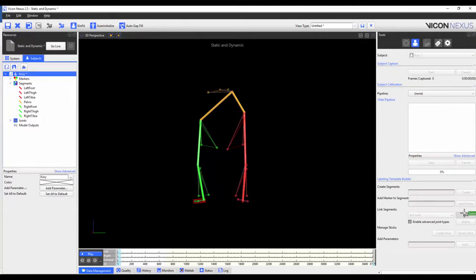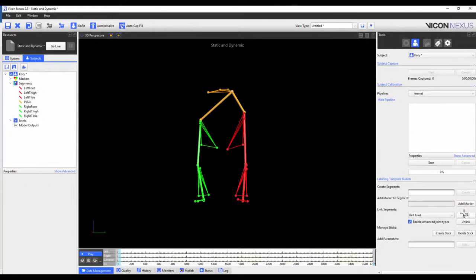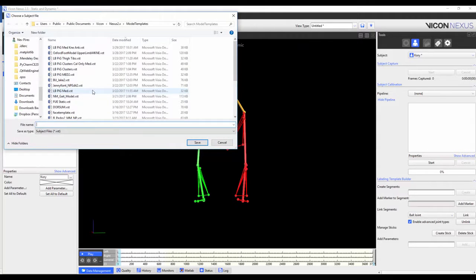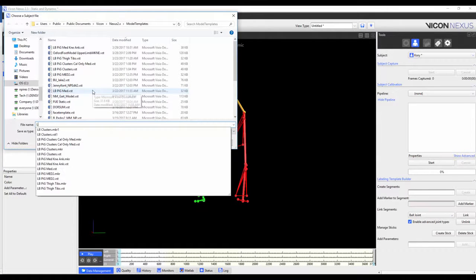I press link to close the loop. Now that all segments are linked, we can see that the subject name is in black, and this is now a good point to save the VST. To do so, I'm going to right-click on the subject name and save labelling skeleton as template. In this case, I'm going to call my template LBClusters.